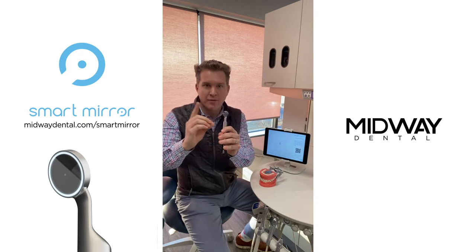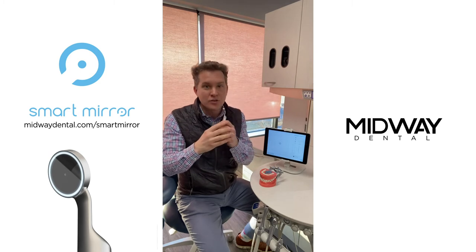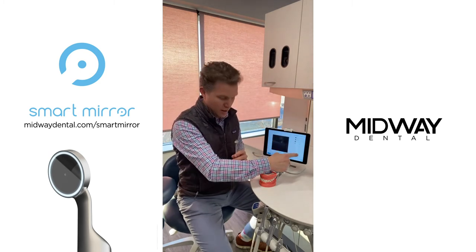In the center of the mirror I have a one millimeter HD camera that streams live everything that's going on in the patient's mouth on my dedicated device. And of course I have the lights.